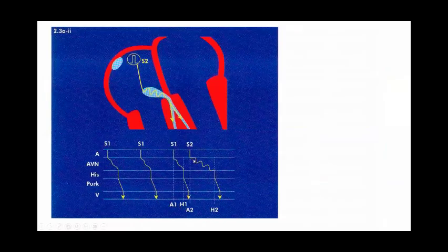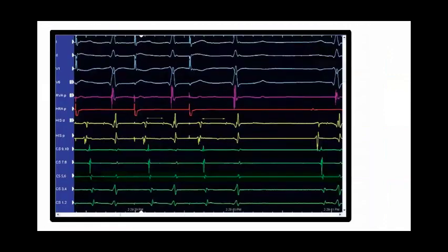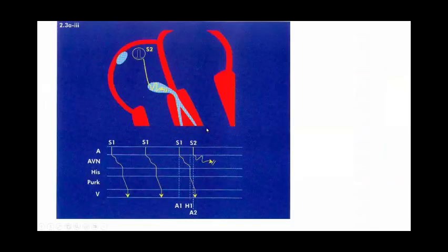This is an example of prolongation. This prolongation can be gradual and occurs in the same fast pathway, but if it suddenly increases, it indicates slow pathway conduction. This is an example of prolongation. And sometimes I reach the refractory period, like if I did it to a normal person or a person without AVNRT or without supraventricular tachycardia, I may reach the refractory period without inducing anything. And even in patients with supraventricular tachycardia, sometimes the tachycardia is not easily inducible by pacing.